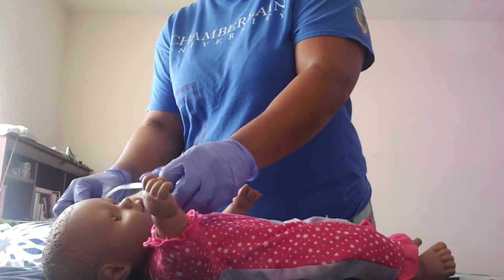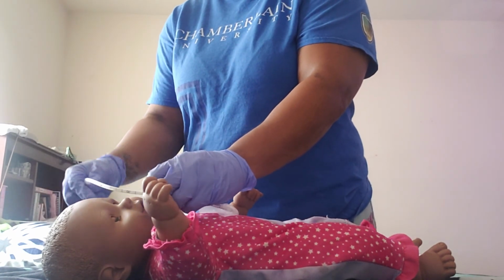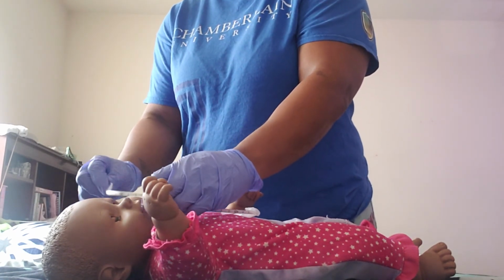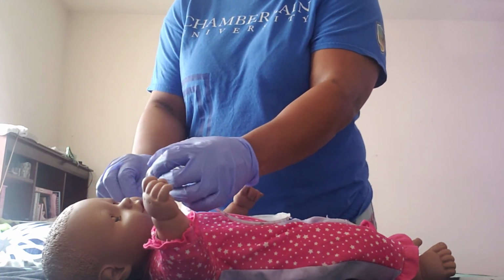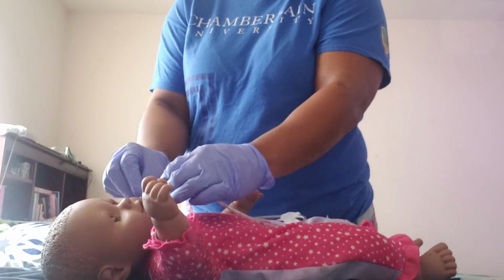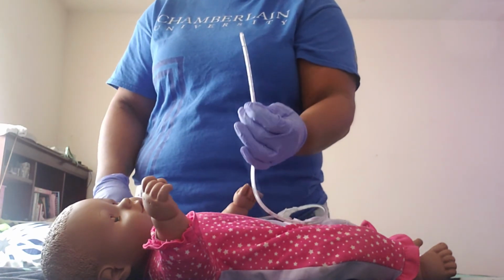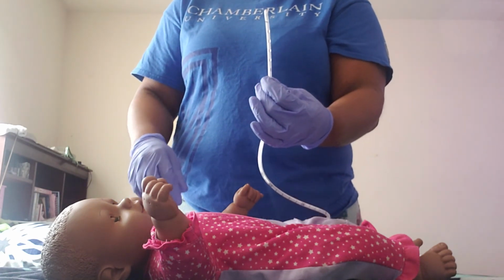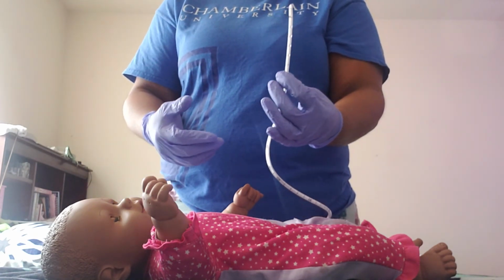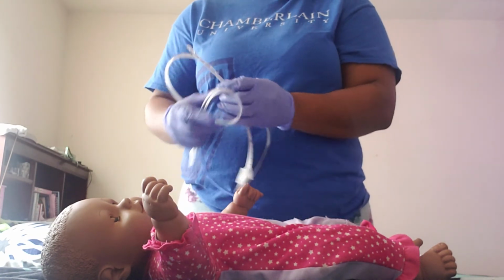And as they're holding their breath, I will slowly release the NG tube from the patient's nose. And once the NG tube comes out, I'll inspect it for it being intact, and it is intact. So I'll go ahead and discard this in the appropriate receptacle.